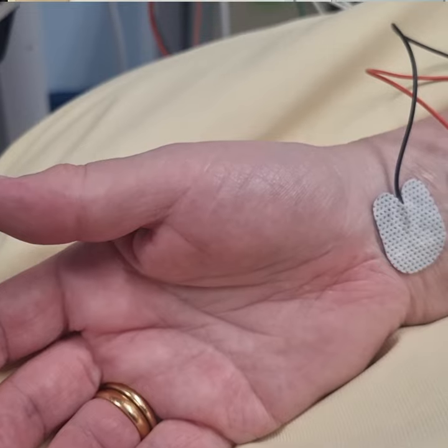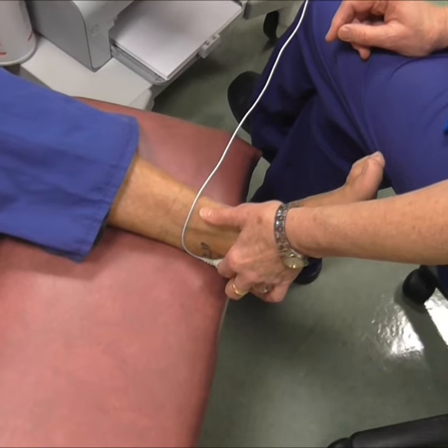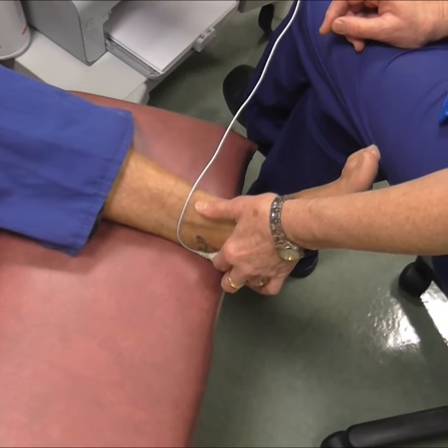We do this through a variety of means: whether it's stimulation of the hand or the foot for the somatosensory pathways, whether it's clicks using headphones for our auditory pathways, or whether it's visual using flash or pattern checkerboards.